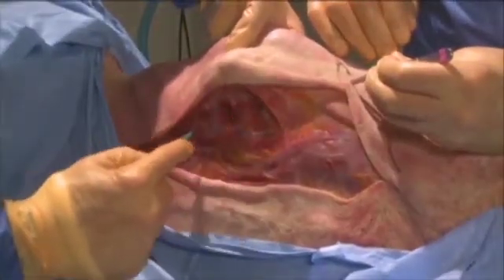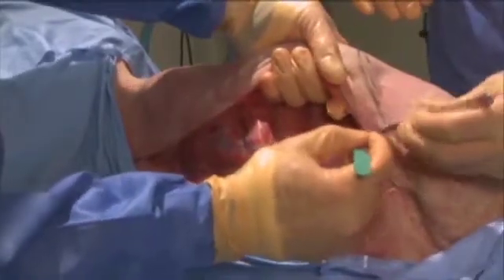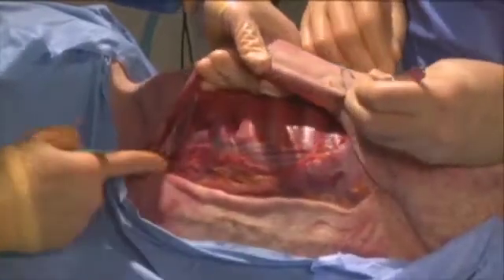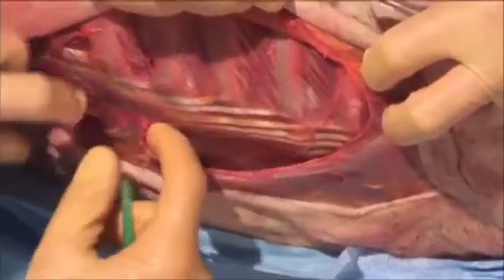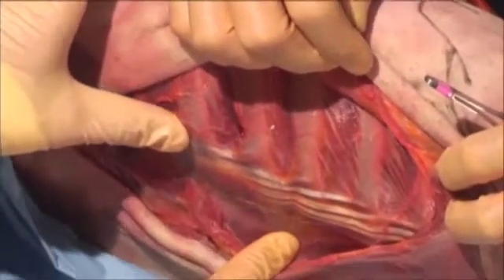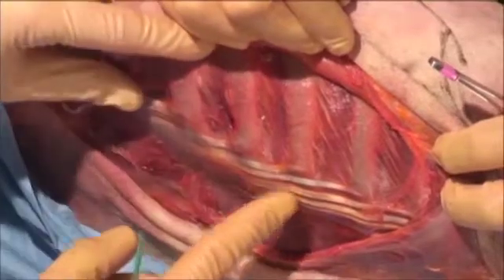I'm sparing the paraspinals and the trapezius, and working along the back. The neurovascular bundle is tucked up under here. I can work all the way down along the back as far down as I want. Now I can work back up underneath the scapula, and work down inside the trapezius. I have the most posterior portion of the rib right here — you can see there's quite a bend, with some paraspinals coming off. But I can plate right underneath the paraspinals.